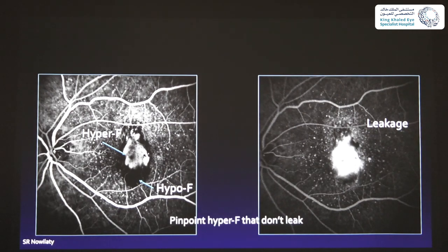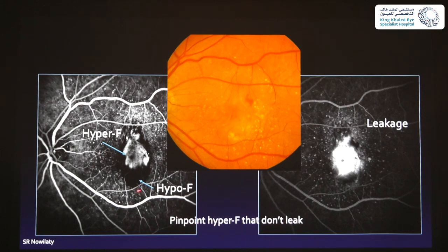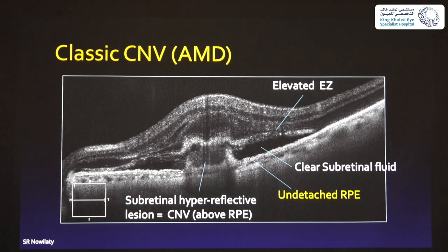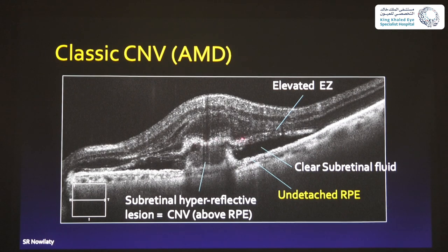On fluorescein angiography, a classic type 2 membrane shows early hyperfluorescence with late leakage. On OCT, you can see something going through the RPE — the ellipsoid zone is disrupted, there is clear subretinal fluid, an intact but bridged RPE, and a hyperreflective structure between the RPE and the neurosensory retina. The best approach is to try to follow the ellipsoid zone and the external limiting membrane — where they're disrupted is where the membrane has crossed the RPE. You have elevated ellipsoid zone, clear subretinal fluid, and a hyperreflective CNV structure.